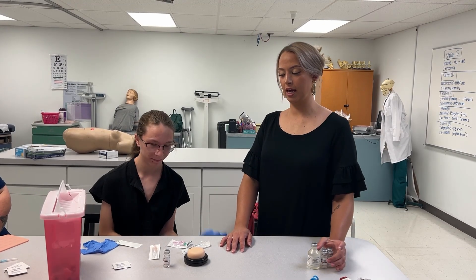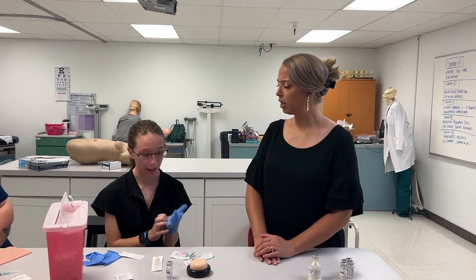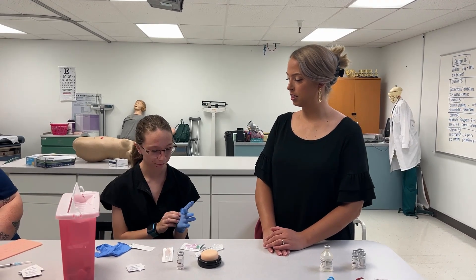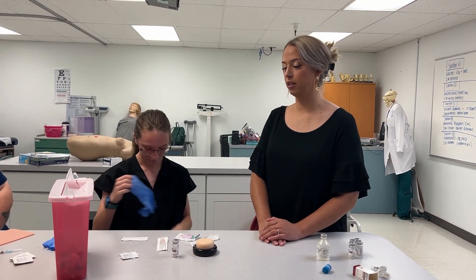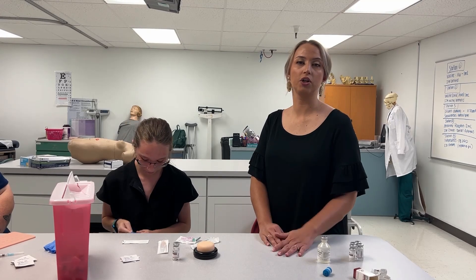We are going to be doing a subcutaneous injection today with an MMR vaccine. First, Lexi is getting her gloves on. The first thing we're going to do is verify our patient's identity — she's going to ask the patient their name and date of birth and verify that she is the correct patient.